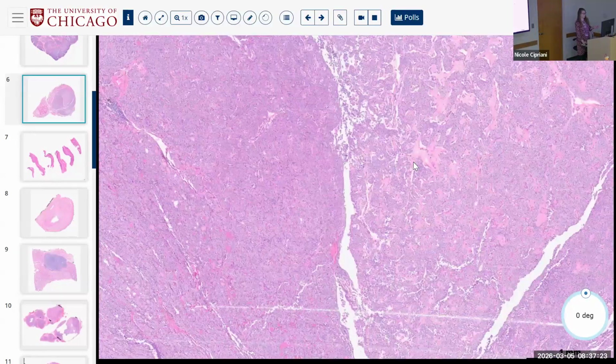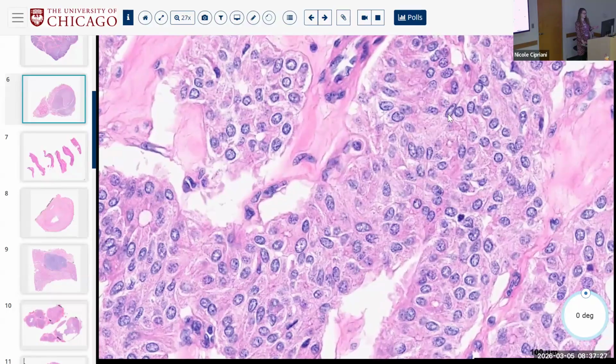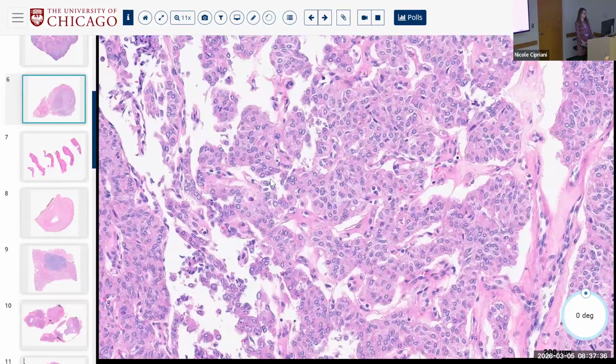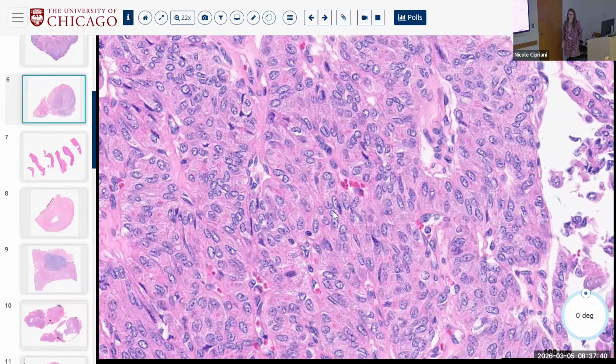The nuclear shape is closer to that of a PTC. Okay, so it's a little bit elongated and a little bit cleared. Maybe there's some grooves here and there. Okay. Are you significantly worried about PTC? No. Right, because the features are still not robust, right? If you were worried about any tumor, what might it be?